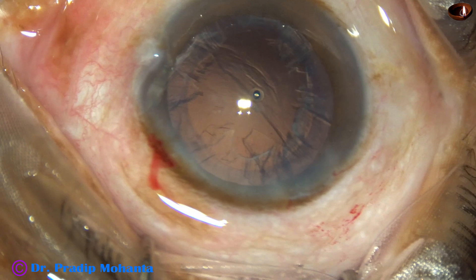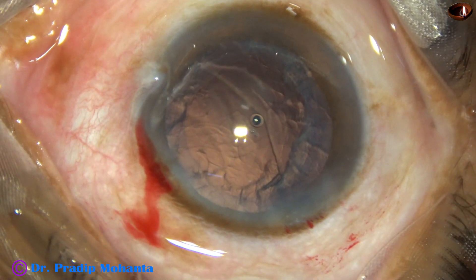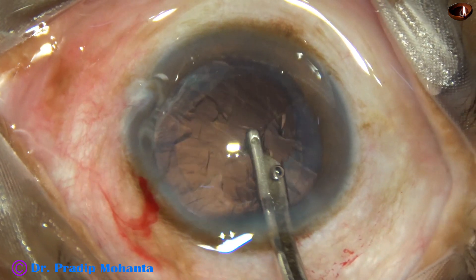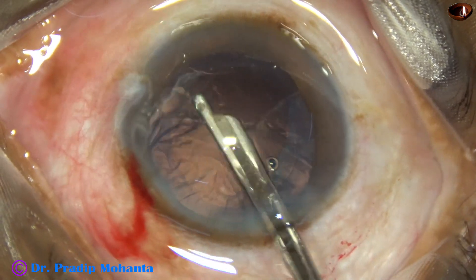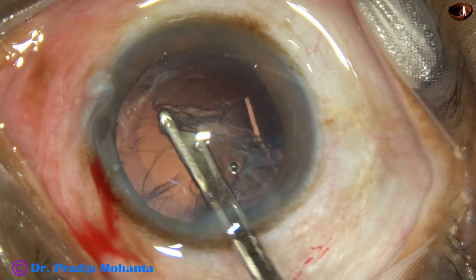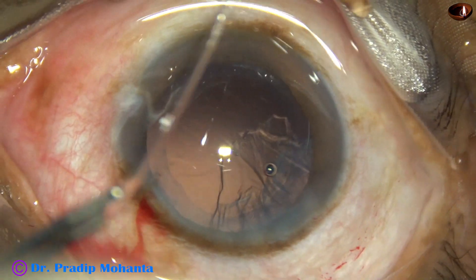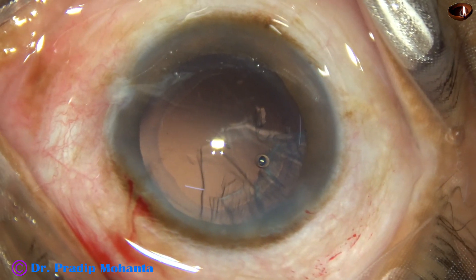A little bit of viscoelastic is injected. Most of the cortex can be removed through the main wound by a Simcoe cannula — this is a 23-gauge Simcoe. We can also use a 22-gauge Simcoe through the main wound. All cortex except the sub-incisional cortex is easily removed by the Simcoe cannula.